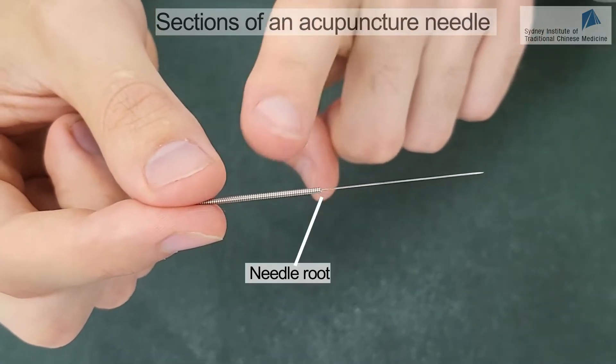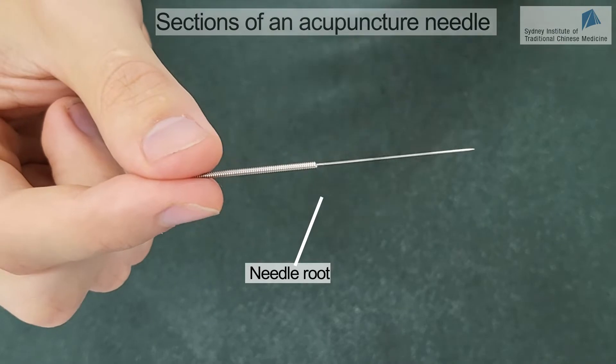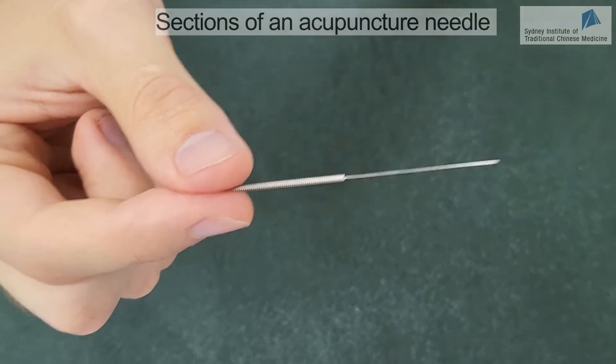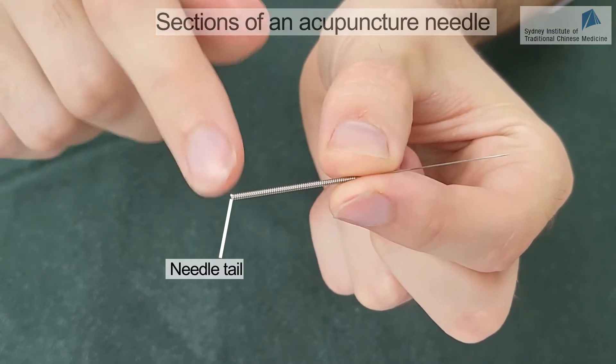Between the body and the handle, we have the root of the needle, which is the most vulnerable part of the needle. Finally, at the end of the handle, we have the tail of the needle.